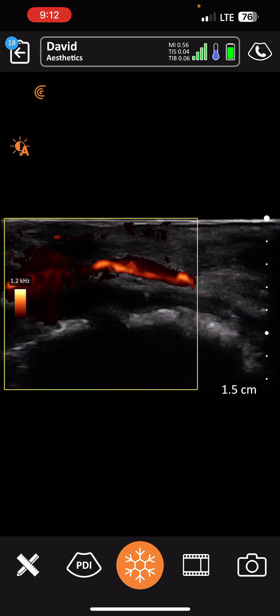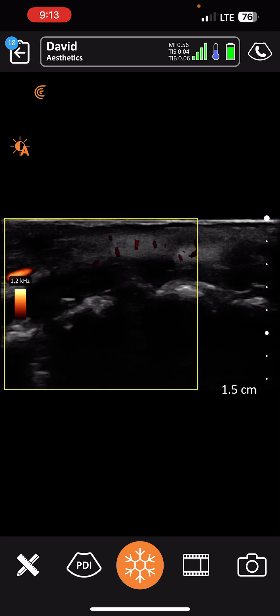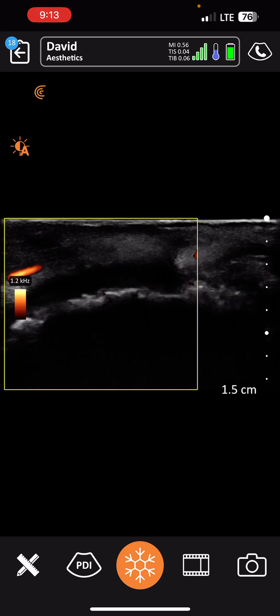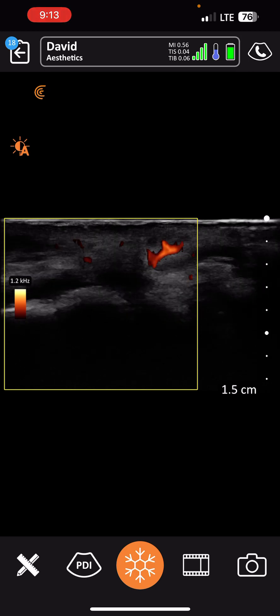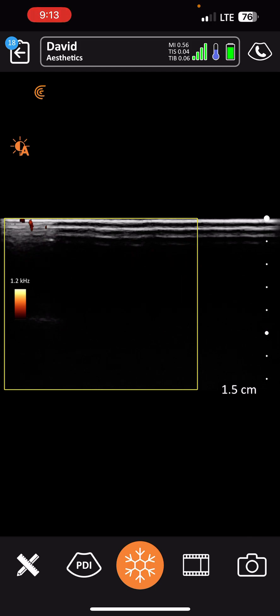We're going to continue to track it. Really nice. Great vascular, and it's tracking all the way across. You doing okay? Yeah, I feel better. Thank you.